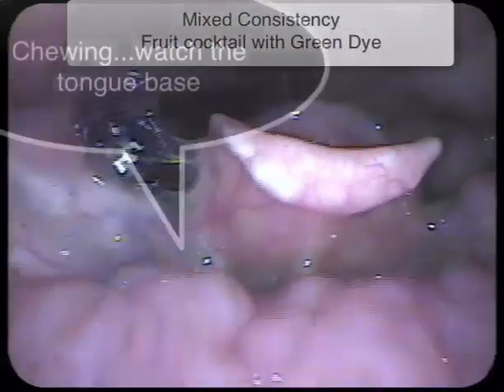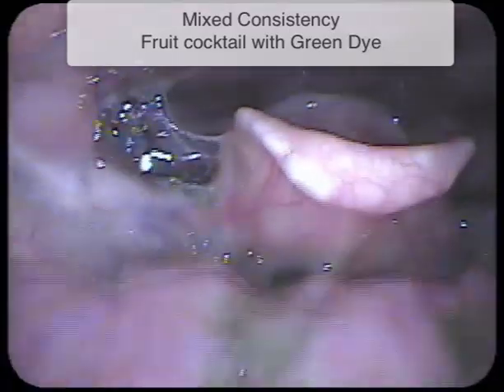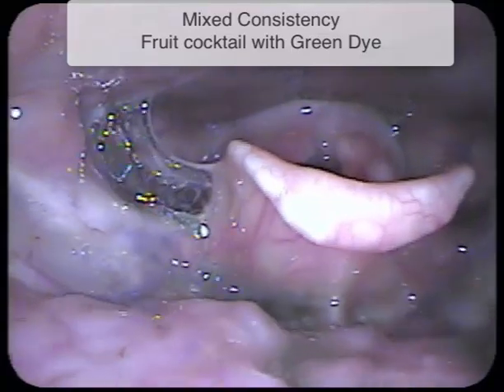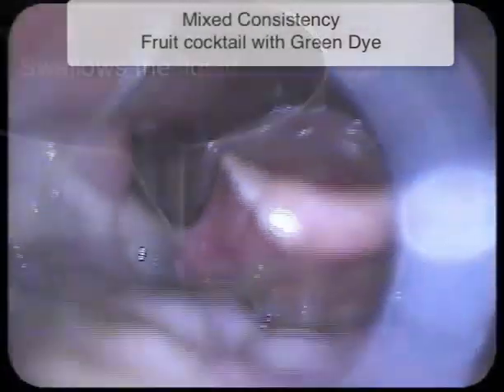Now let's watch a mixed consistency that requires some chewing. Here we're going to watch some fruit cocktail with green dye. See how the bolus begins to fall over the base of tongue? When the swallow triggers, we see pharyngeal compression that results in white-out.